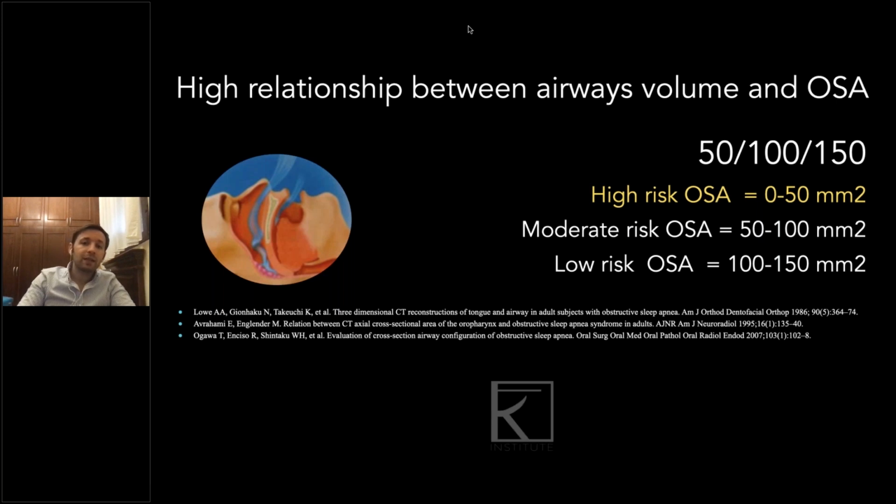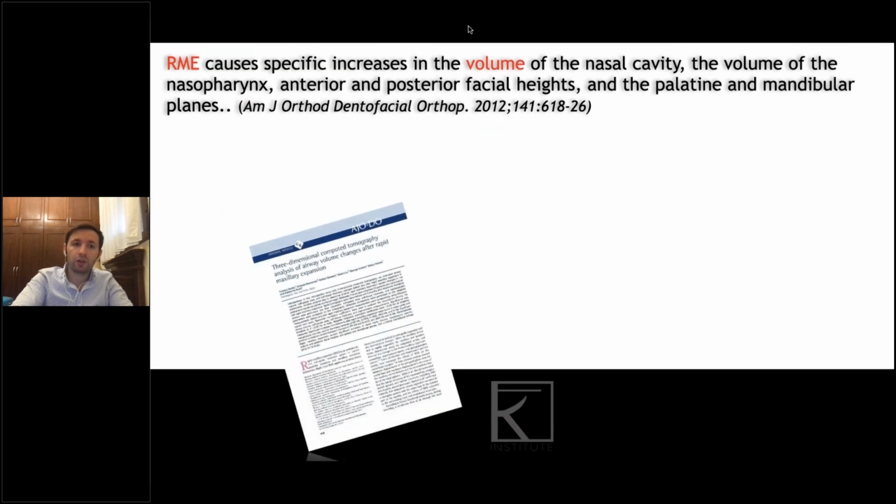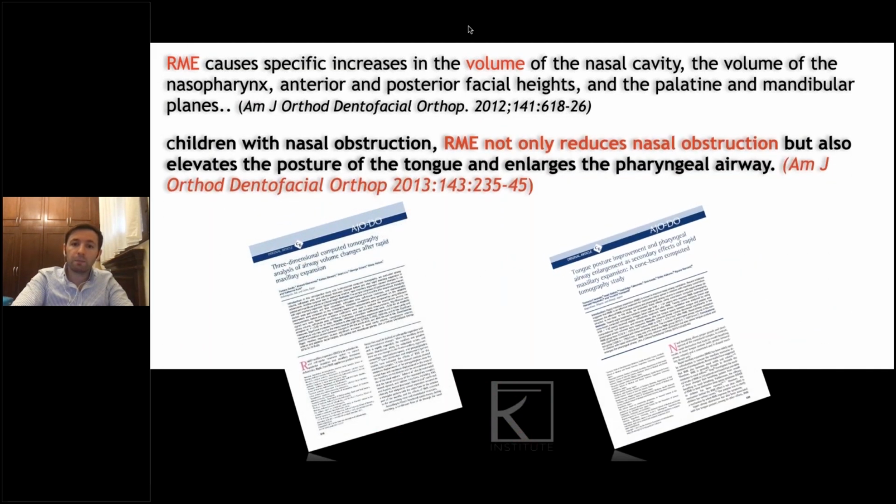We are not the specialist who has to diagnose this patient, but we are the one who has to say, okay, I recommend you to visit the sleep doctor in order to make you a polysomnography because you have a high risk to suffer sleep apnea. So I give him my CBCT in order to improve the diagnosis. And I want to show you the relation between expansion and the improvement of the airways.